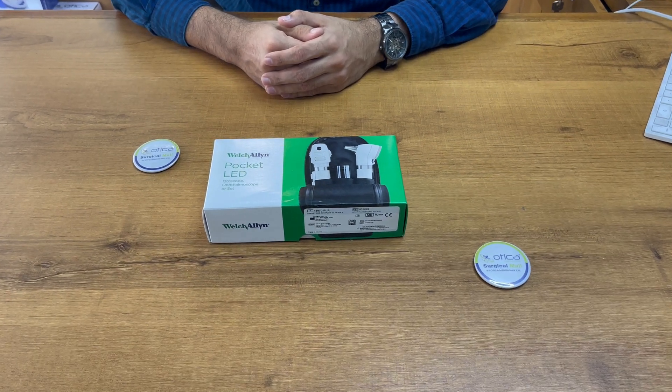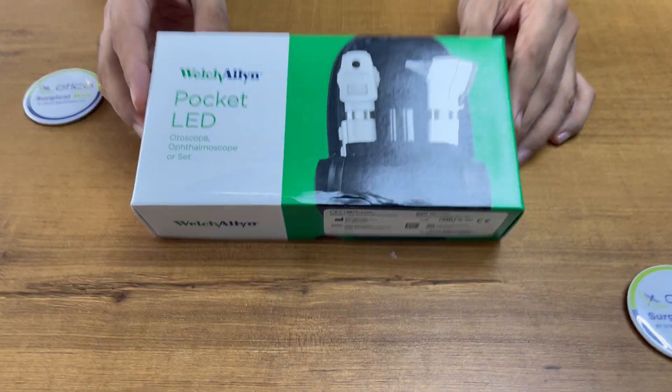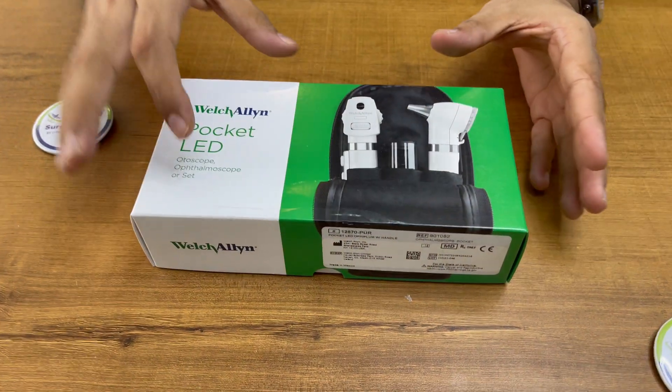Hello friends, welcome to Otika Meditronics Company. Today we are going to demonstrate how to use, or unboxing of, the Welch Allyn Pocket LED otoscope and ophthalmoscope. Basically the box remains the same for both.